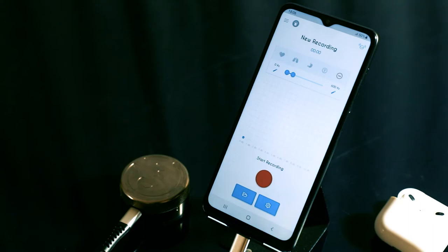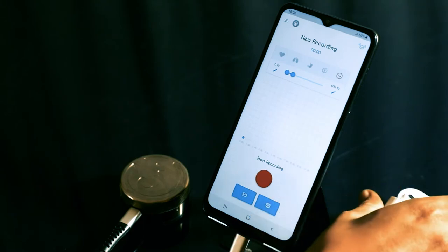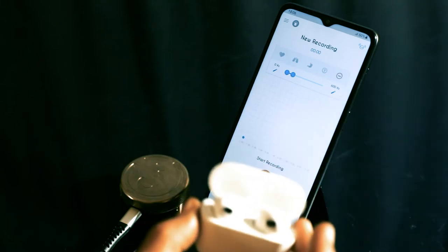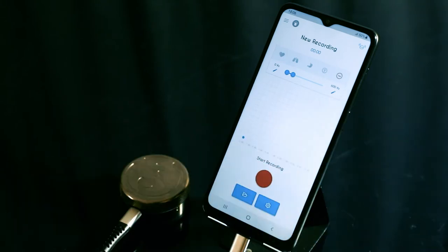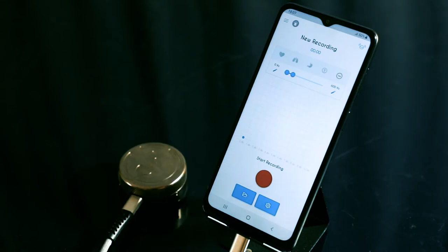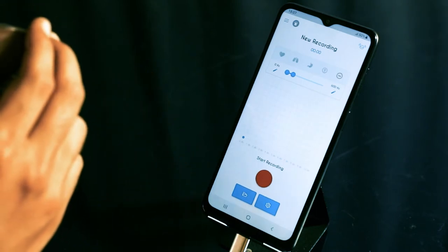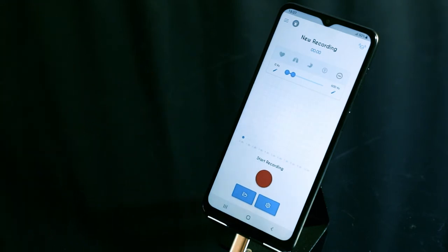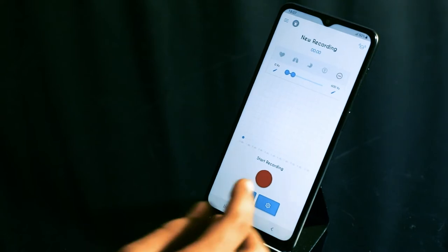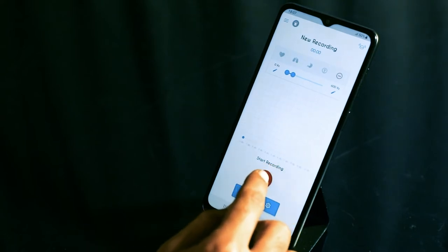To start recording a sound, first put on your Bluetooth headphones. Then, place the Tal digital stethoscope on your chest or your subject's chest and start recording.